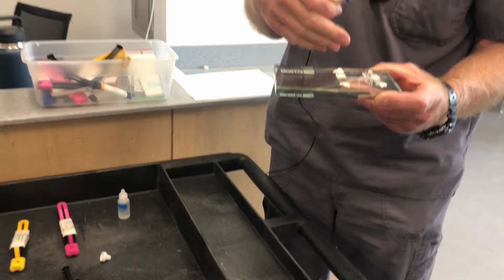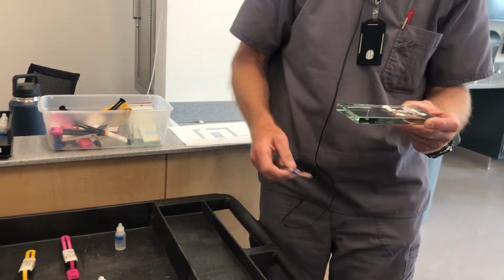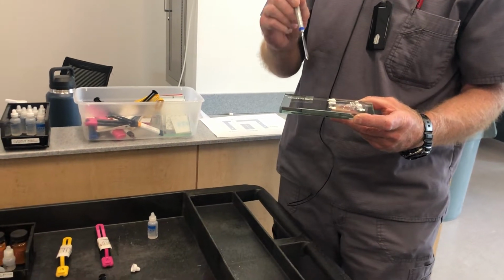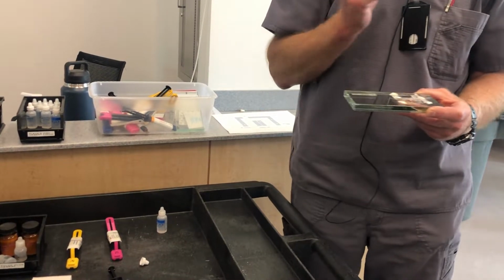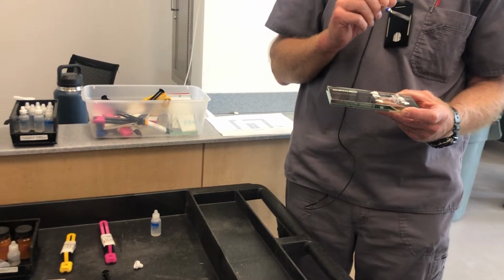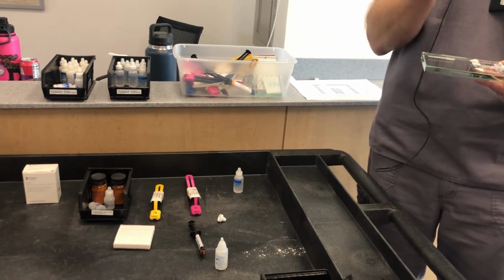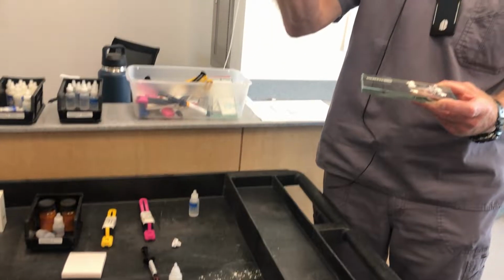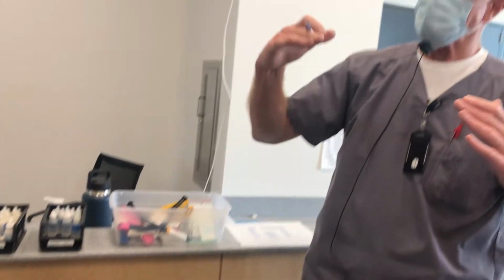Again, I'm not going to go into a lot of detail with zinc phosphate. It's interesting from an historical perspective. The major downside, besides the postoperative sensitivity to zinc phosphate, you remember what it was? Irritation of the pulp. Well, it would do that because of the acidity, absolutely. What was it? Does it dissolve? Yes, solubility. You're absolutely right. And that's one of the reasons that tight margins were so absolutely critical with some of these materials.